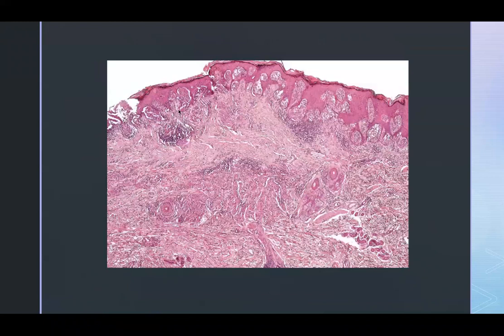So here's an example. Looking at that junctional component, you may be worried right off the bat that it looks very similar to a melanoma in situ. You might think that these are nests with pagetoid upward migration, some areas of contiguous growth. You have this mid part of the trizonal arrangement, which is that scar there with the east-west collagen, and then a deep dermal melanocytic pigment there.